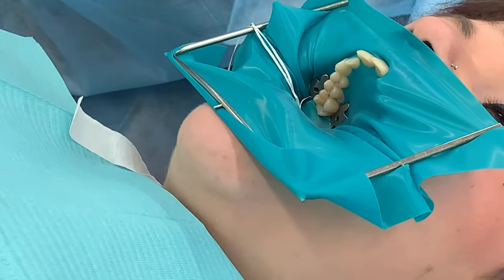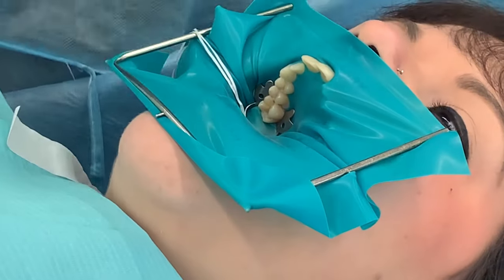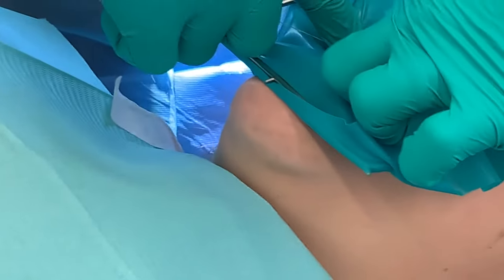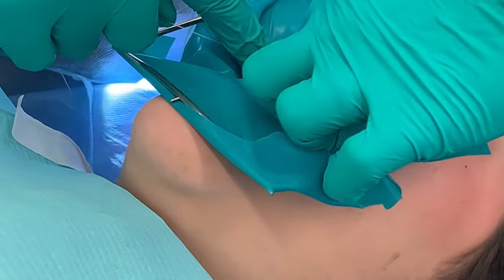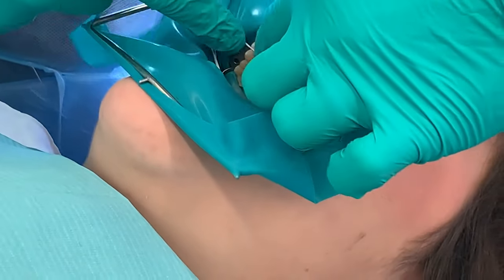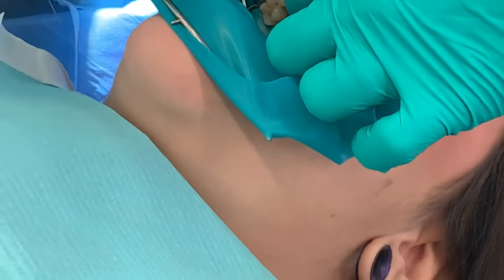Let's grab our floss. We like to invert the dam, and how I like to do it is with some floss. I need to go down the contacts anyway, so I put it down each side of the tooth. You'll see that by doing that, it actually inverts the dam if you push it down into the sulcus of the tooth.